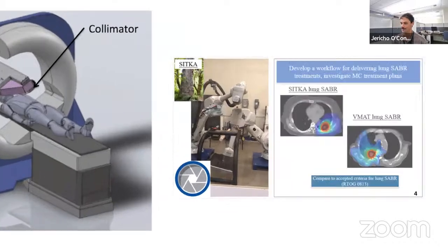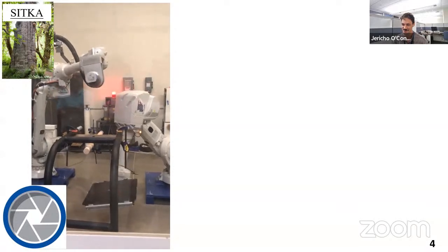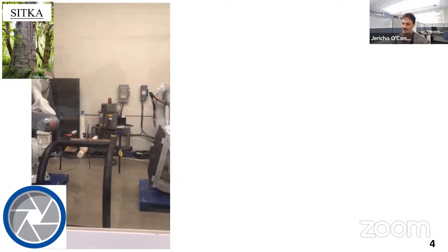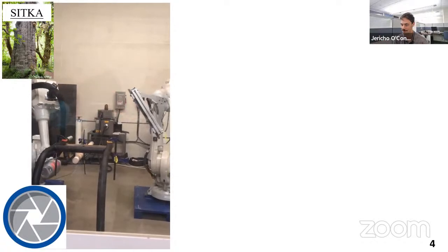So we switched to a different type of device, and here's the prototype that's being made with a company called Orimtech in Chicago, and in collaboration with Serious Medicine, which is a startup in California, mostly Michael Weil. And here is a prototype machine, and you can see it's acquiring a cone beam CT right here. And it's a little simpler. It has the two robots holding a flat panel and an X-ray source.